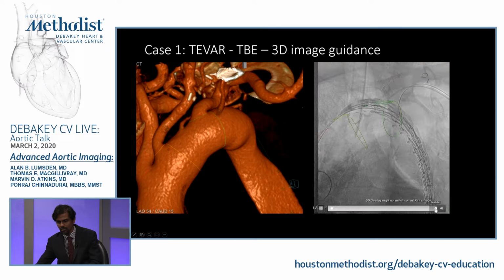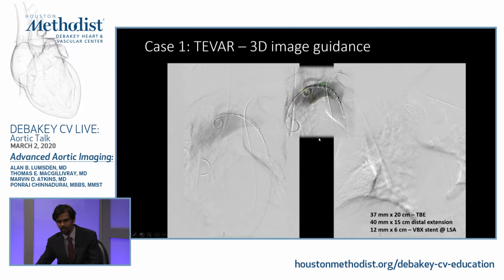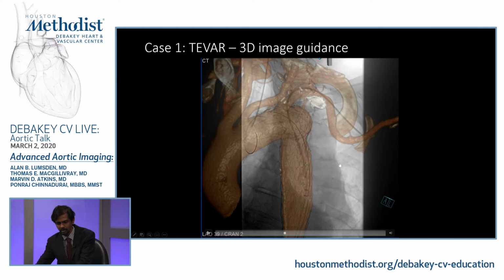This is an example of deployment of the device, and we do one confirmation angiogram, and then the device is deployed. So this is the pre-aortogram, and this is the post-completion angiogram, and we extended it by another 15 centimeter device.